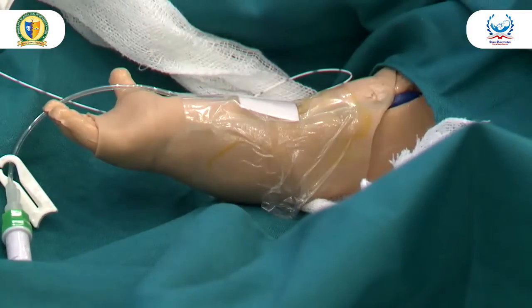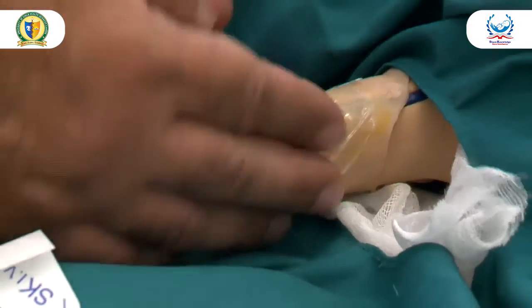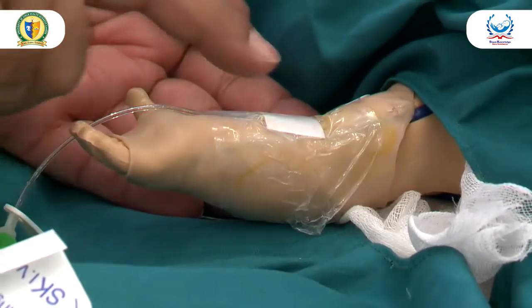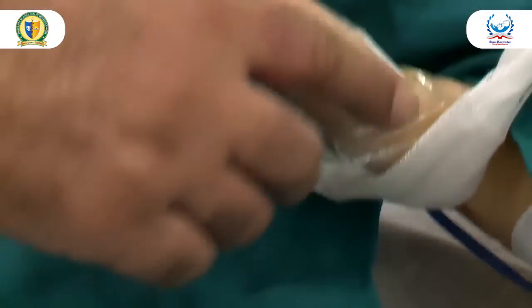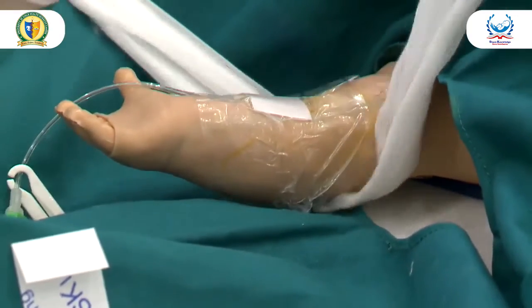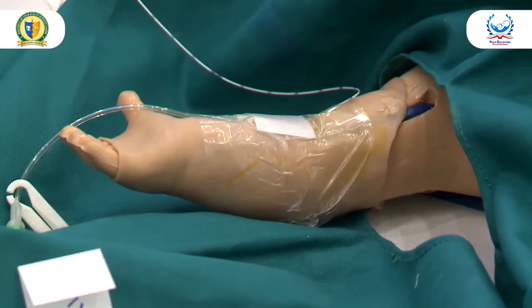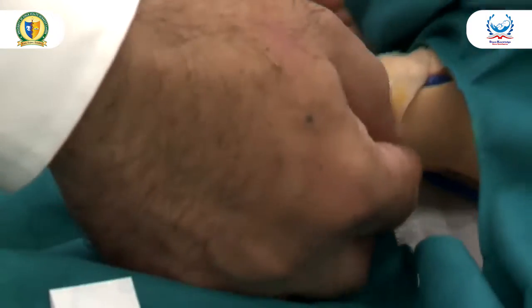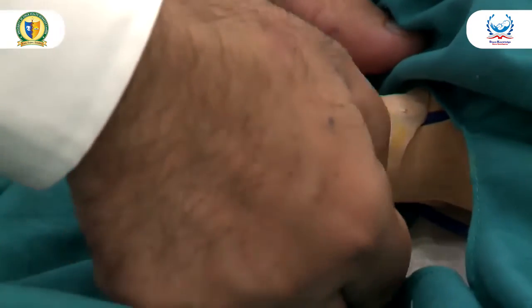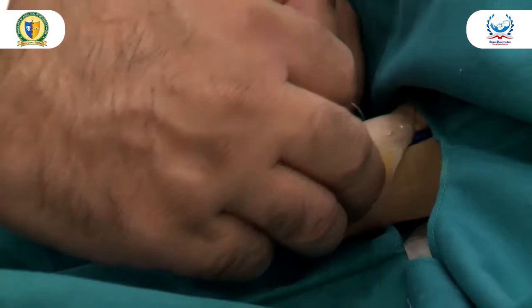Yeah, as she did, it is a very nice, clean line. You can see it is covered. She covered the entry point completely, and she did not fully encircle the arm like this. One area must be left open, and the indications are there to take it out. Just peel one side like this.